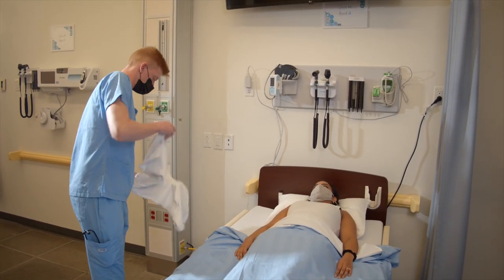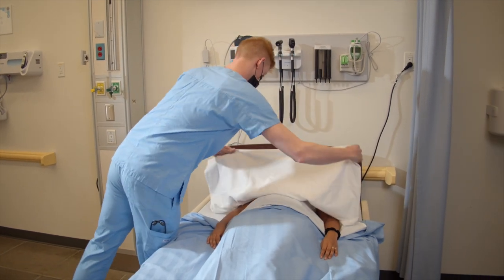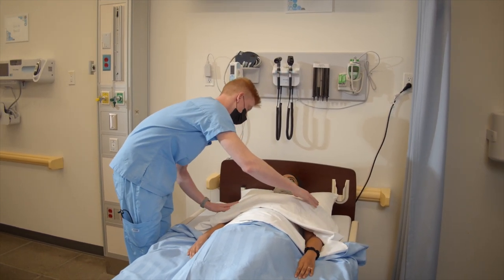I'm just going to place this drape over your chest. I'm going to start by touching your chest and landmarking my way down. Is that okay?